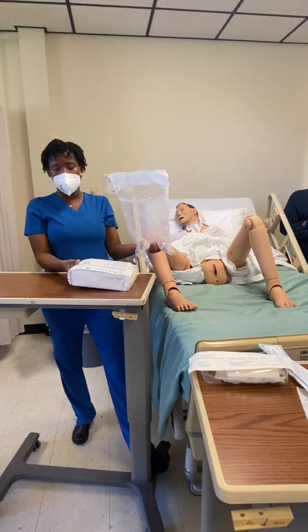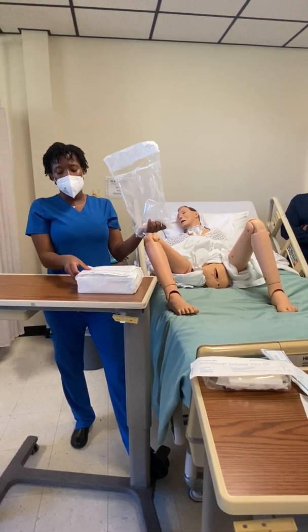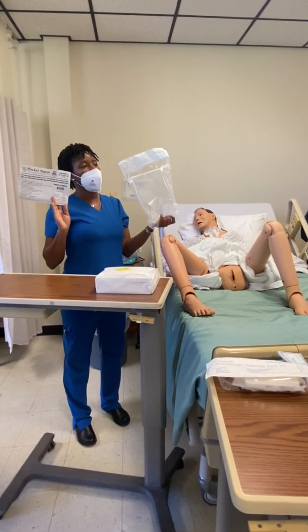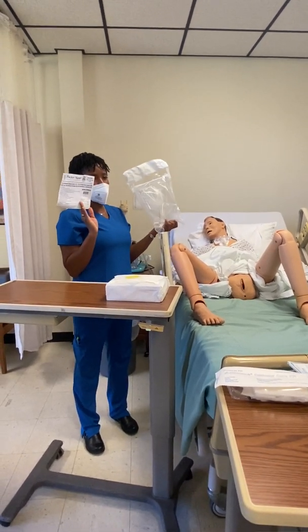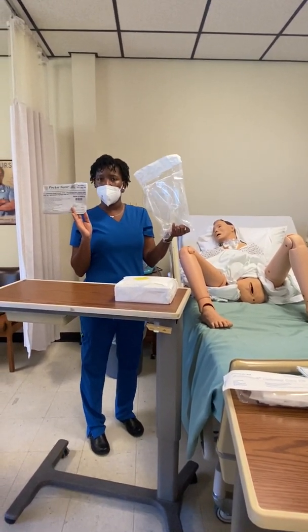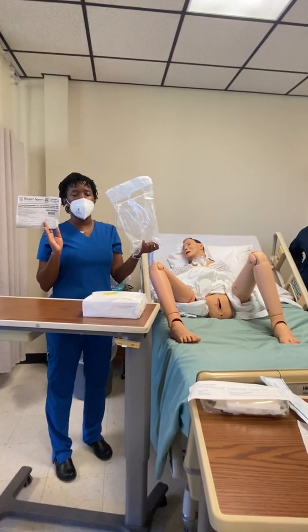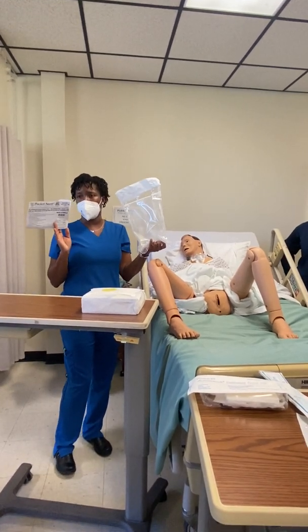So, now, I'm going to take it out. Is anything sterile as of yet? No, it's not. So, I'm going to take this and I'm going to sit it to the side. Why am I going to sit this to the side? So you know what size? So I know what size, because I got to document what I did at the end and what I inserted in this patient. Okay? So I can document the size, and it'll have on here the size of your balloon as well, but that's also on your catheter, and I'll show you that. Okay?